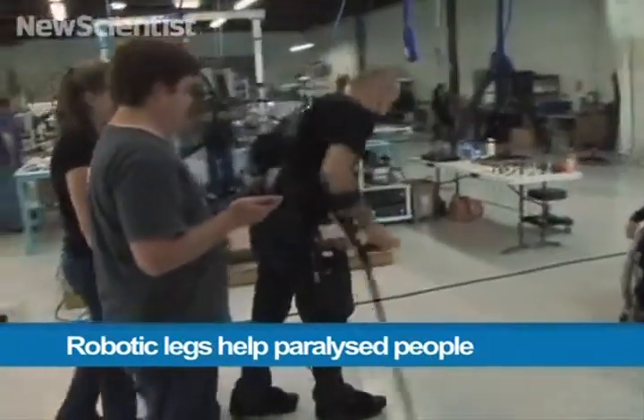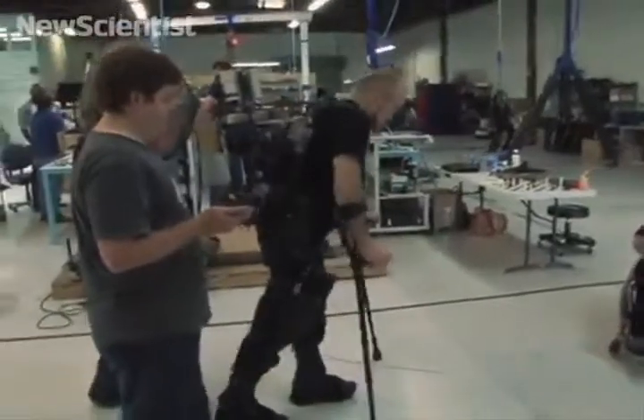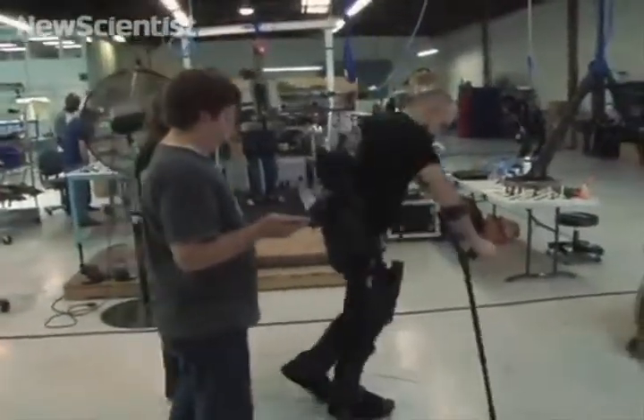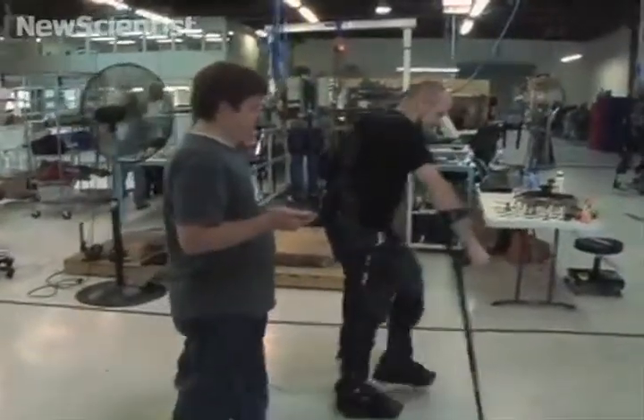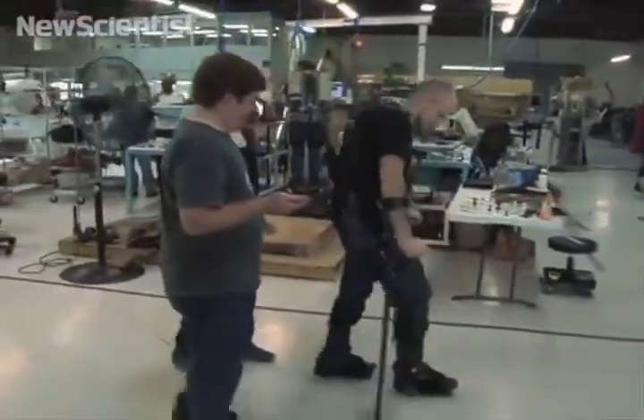Here in California, a new exoskeleton called E-Legs could soon help paralyzed people walk again. Similar robotic devices are already used by the military, but this one has been designed for rehabilitation.